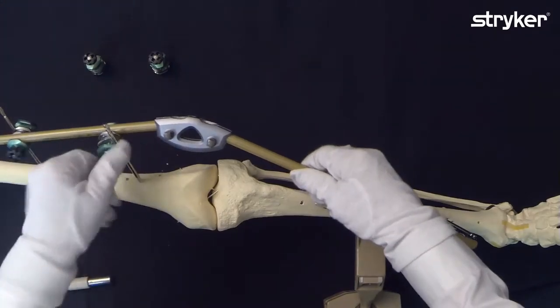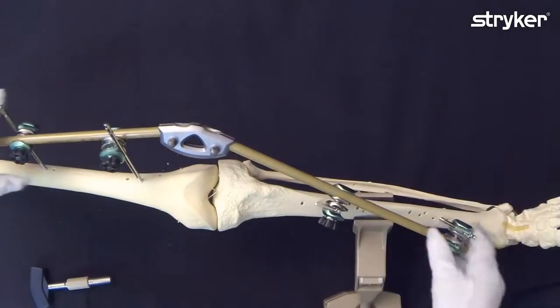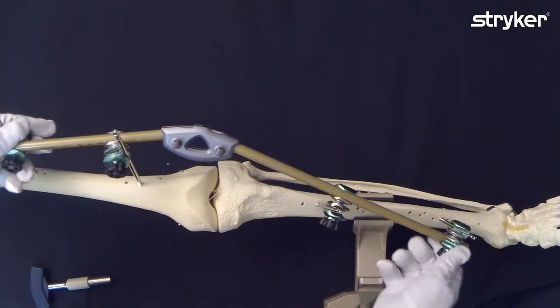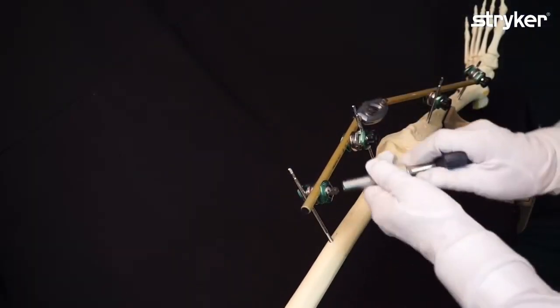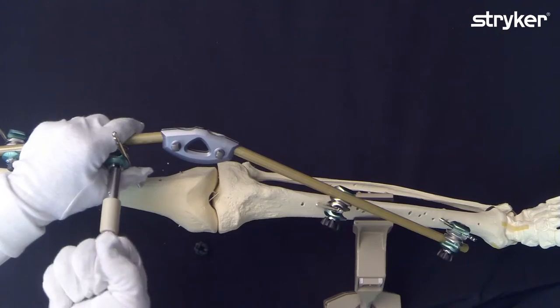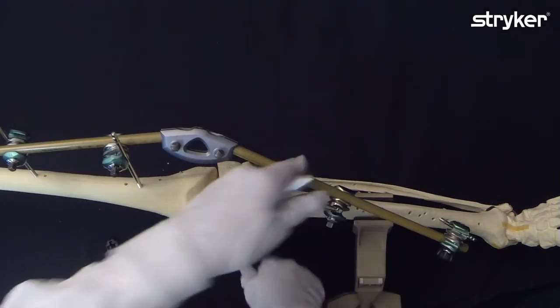Retighten. Okay. Just final tightening. Make sure the rod coupler is tightened as well, although you've done that already on the back table.